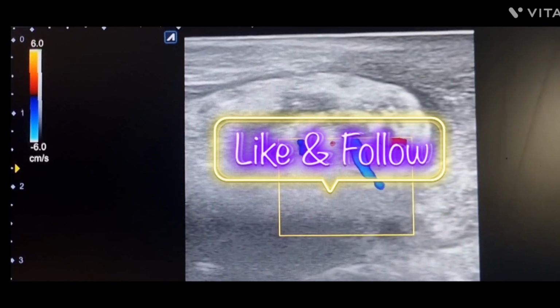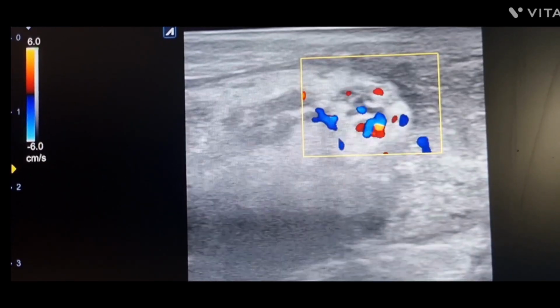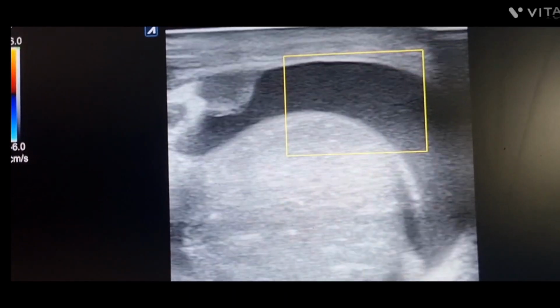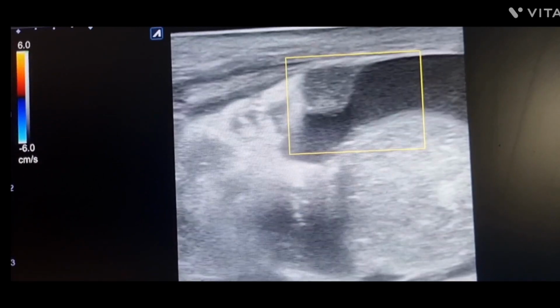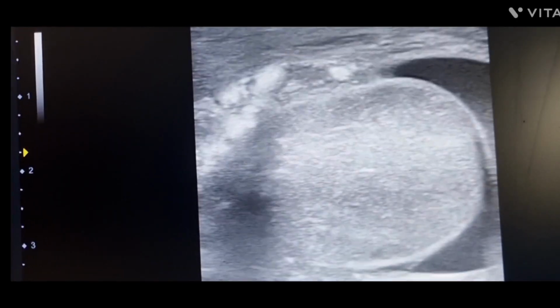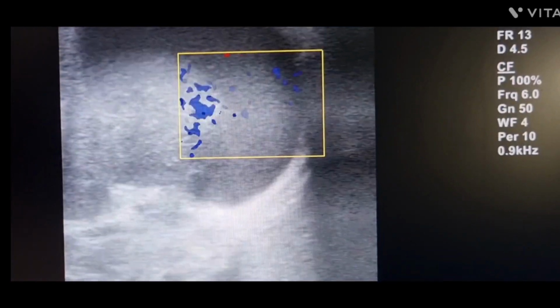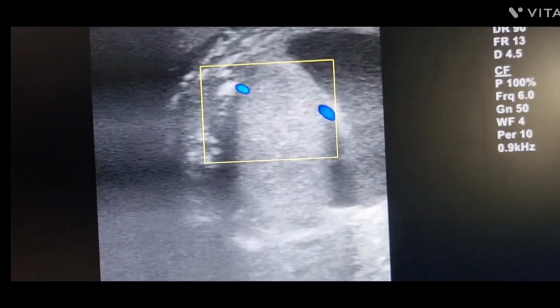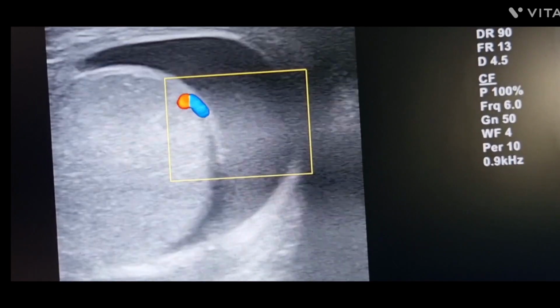Usually the source of infection in these cases is from the bladder, prostate or urethra, or any active intervention done such as catheterization. Treatment options we have are proper antibiotic coverage and analgesic, proper scrotal support, and treatment of the underlying cause according to etiology. So in a nutshell, we see a case of epididymitis and funiculitis with reactive hydrocele and scrotal wall edema.